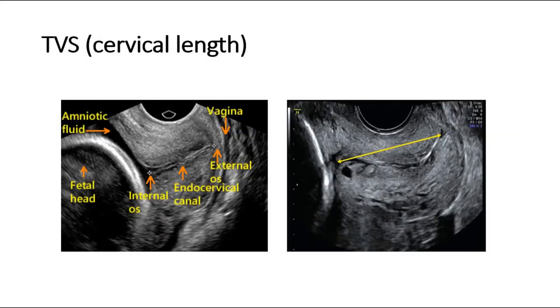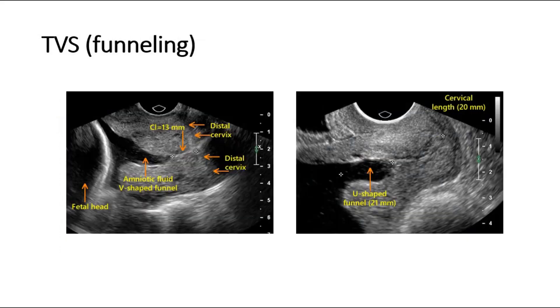These pictures show the cervical length seen on transvaginal ultrasound, with labeling of the amniotic fluid, fetal head, internal OS, external OS, and vagina. Cervical length is measured as the distance between the internal and external OS. Additional pictures show funneling: the first picture shows amniotic fluid causing a V-shape funnel, and the second shows a U-shape funnel.